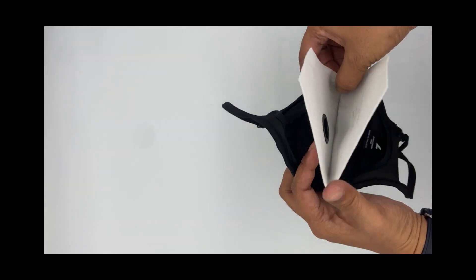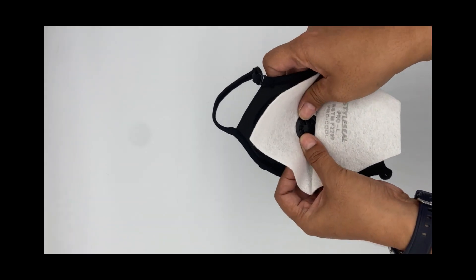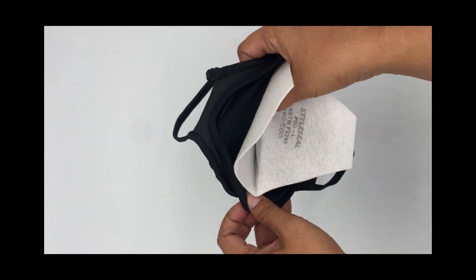Open the Pro Mask so you can see the inside of the valve. Align the snap ring on the filter to the valve and snap it in place.